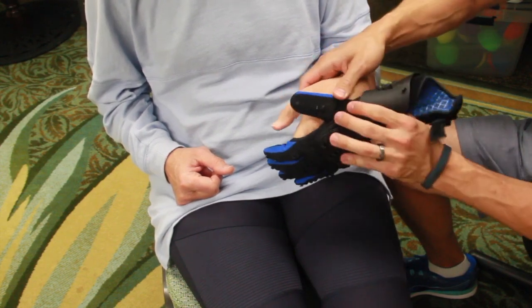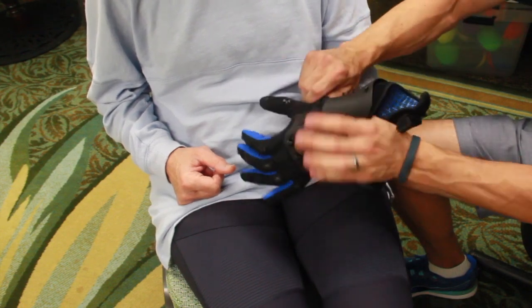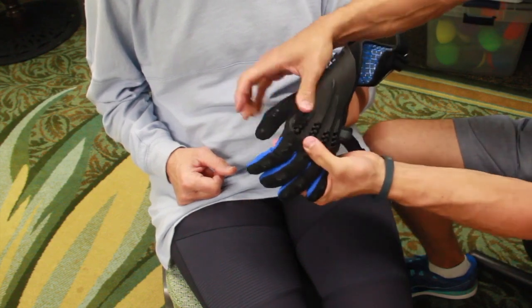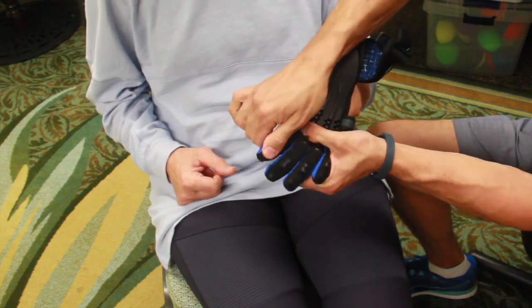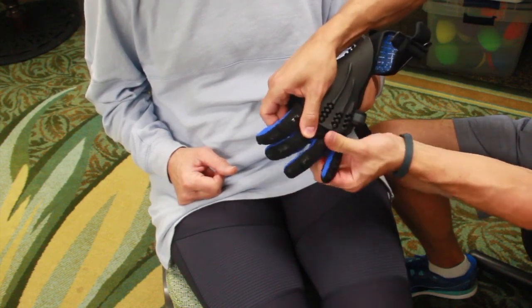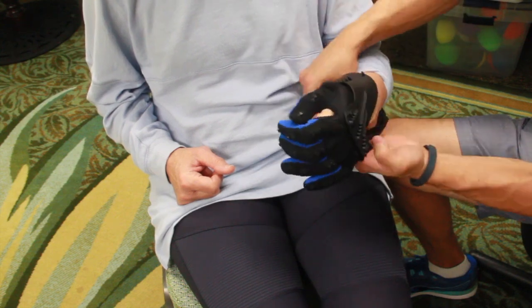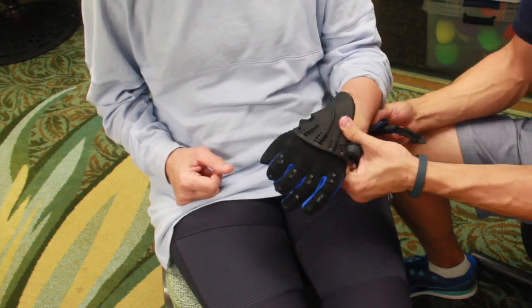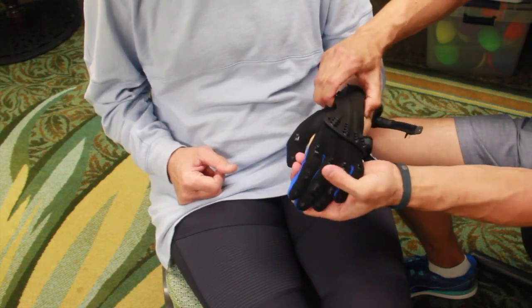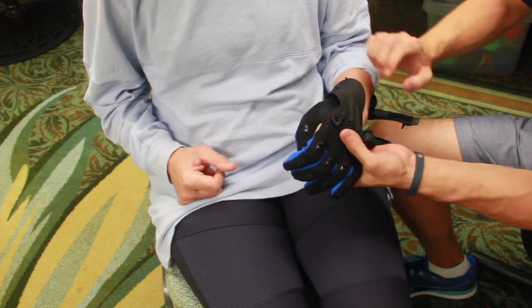And as you pinch that fabric and pull it up as far as you can, then you can proceed to the thumb and do the same technique. Once the fingers are in all the sleeves, you can then pull on the plastic hooks that will help give you some leverage as you pull the device all the way up the arm, and then wrap the forearm shell around the forearm. And then at that stage, you can pull it up all the way towards the elbow as tight as you can.